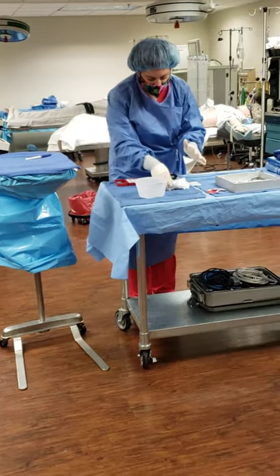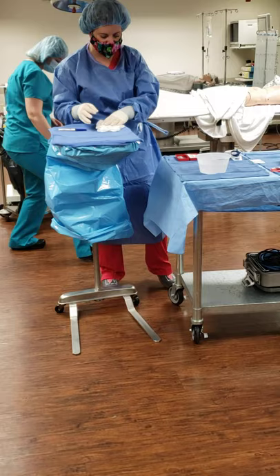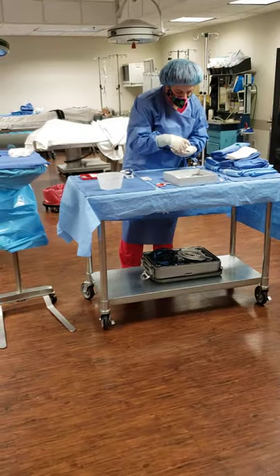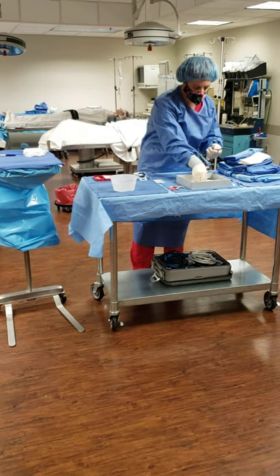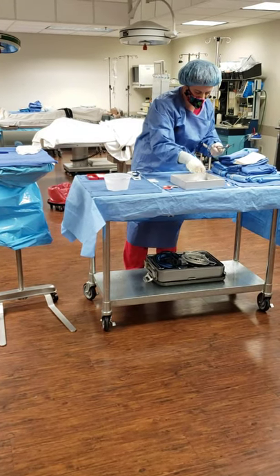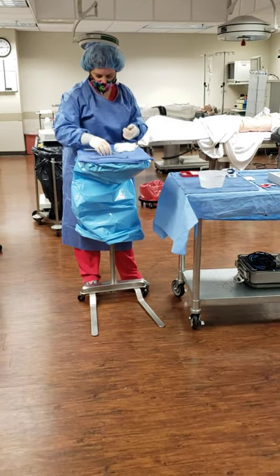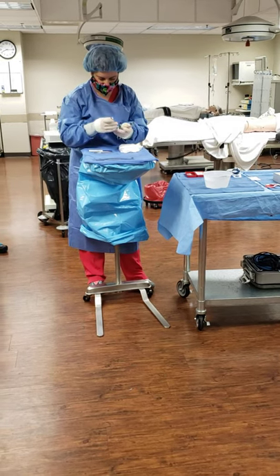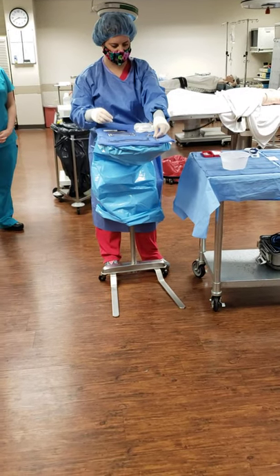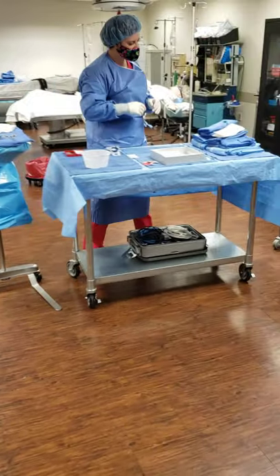So I did my count, I got my meds, now I can set up my Mayo stand. I decided I'm going to make this my working area, so I'm going to put my sponges in the opposite corner. There's more than one way to skin a cat, but this is the way I do it. Make sure you lock them, or you put them on your Mayo stand — close them. I'm just going to grab everything because I know everything's going to go up there anyway. For this, there's not a lot of stuff — I just usually put it in a line.